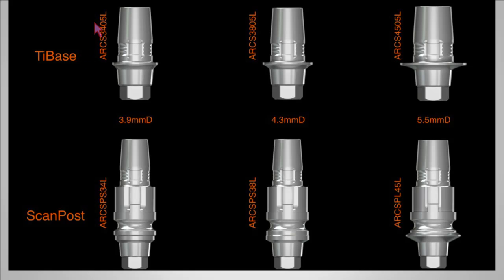Now, these are the model numbers for each of these specific components. I'm certain that we'll be able to share this presentation after it's been provided through Viva Learning, so that for those that are interested in ordering these parts and pieces directly from MegaGen, you'll have the appropriate numbers.